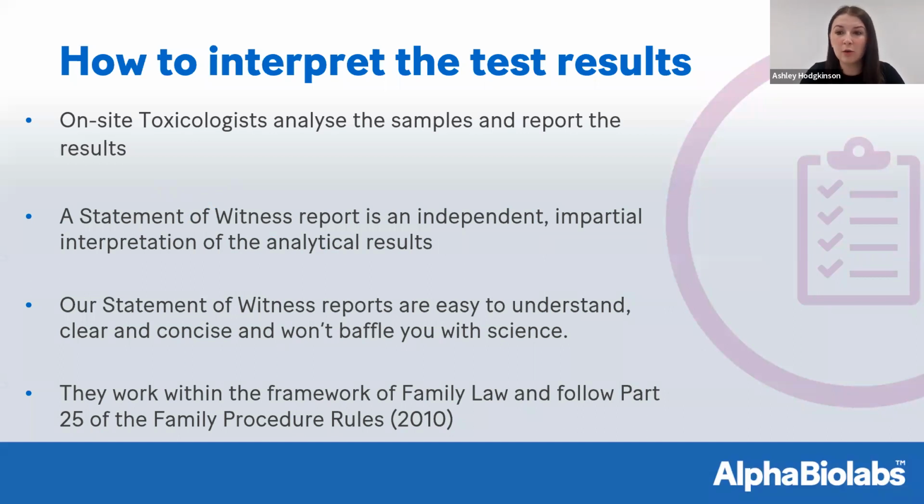This is a very basic report. Again, it's more commonly requested if someone is just looking to provide a negative report to court, where no write-up would be required, no additional explanation would be needed. The certificate of analysis would be fine for that purpose. It does just include the basic results. So if it was negative, or if something was detected in the sample, the value of that and the cutoff level it was tested against, but there is no write-up or any additional information in a certificate of analysis.